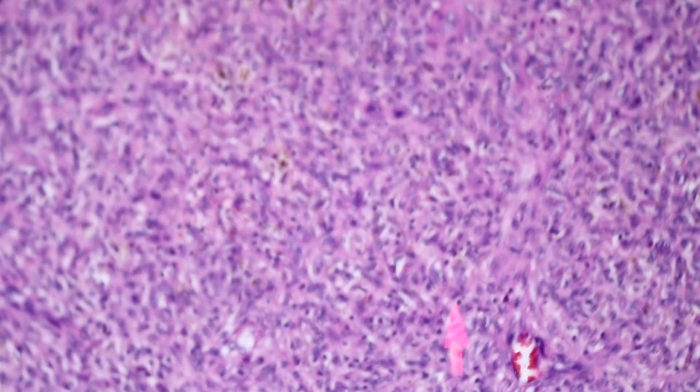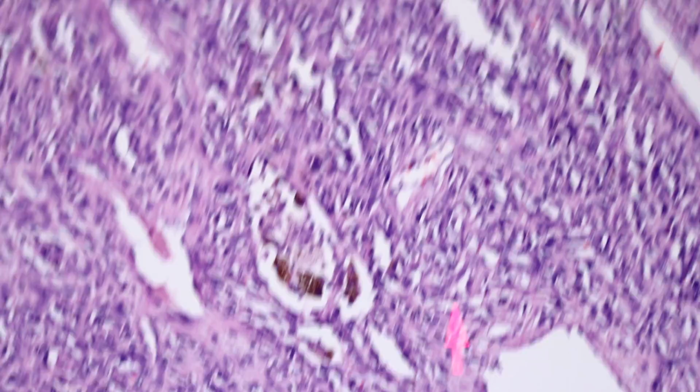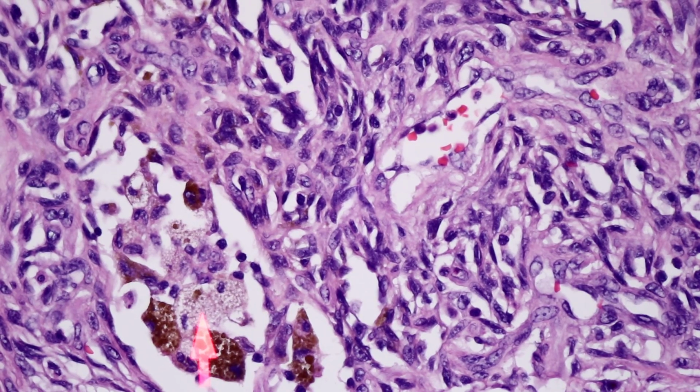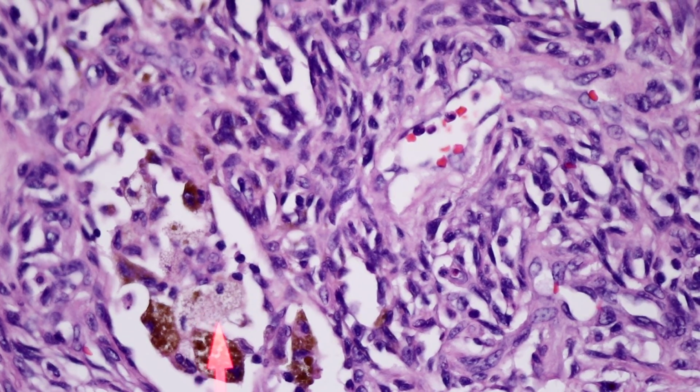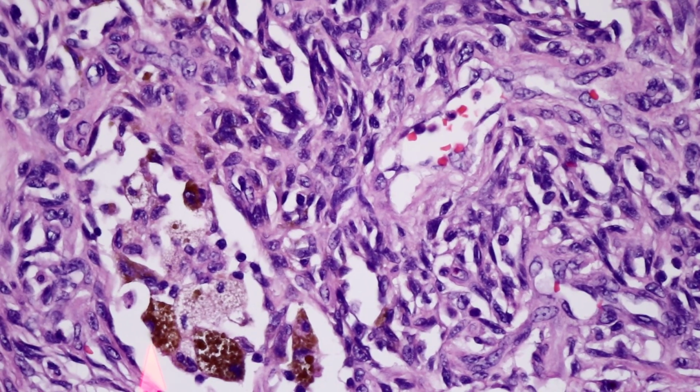And in these cases that have hemosiderin and also that have hemorrhage, you'll tend to see a couple other things that are often prominently featured. Not only do you see siderophages, but you'll see foamy histiocytes. Oftentimes in these little blood-filled spaces, you can find foamy histiocytes, usually with a bit of hemosiderin in them. And you'll often see giant cells as well.